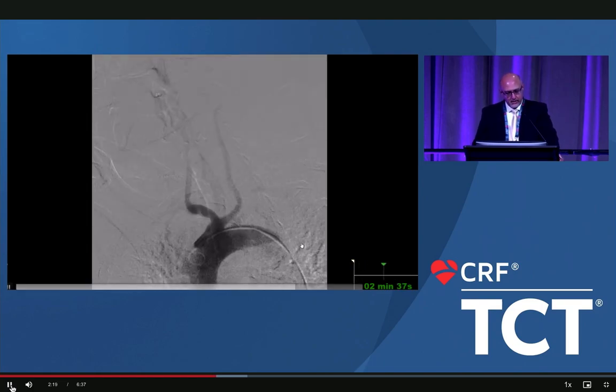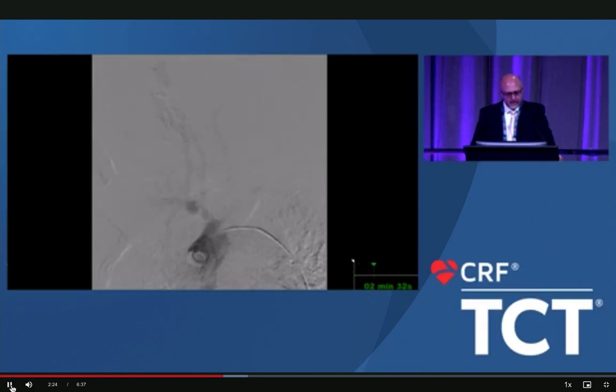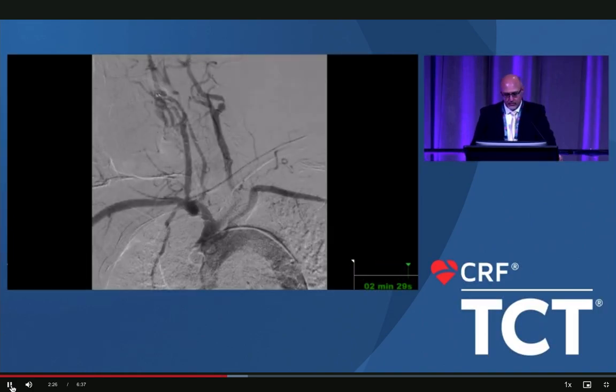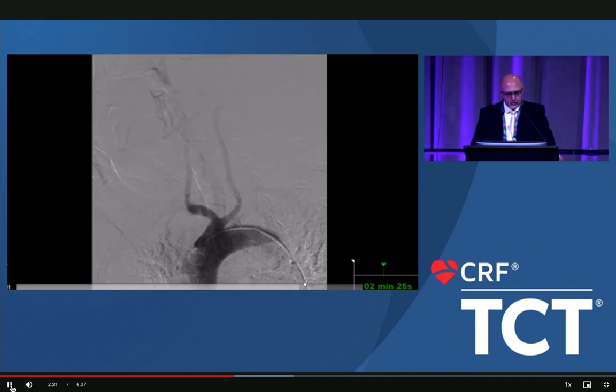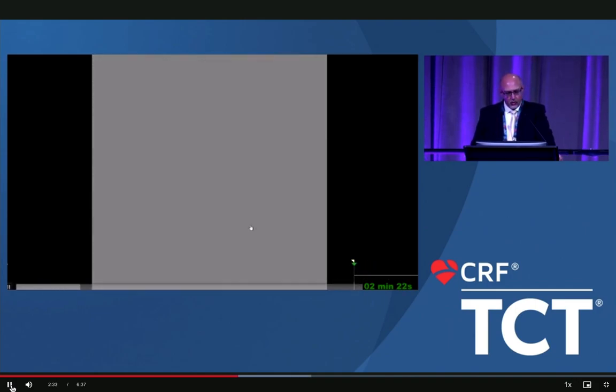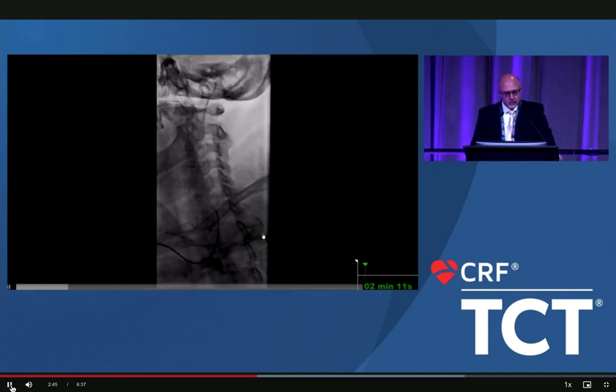So at this point I paused because of the complexity of the arch and also because of her renal insufficiency. I decided that I should probably stage this intervention rather than jumping straight into it. And the more I thought about it, rather than coming transfemoral through the aorta and trying to navigate this reverse turn into the left common carotid artery, I decided in this case the most straightforward approach would be to come transradial to get into that left common carotid artery with our interventional equipment. So we placed a slender sheath in the right wrist. I used a 5 French diagnostic IM catheter to engage the left common carotid artery.